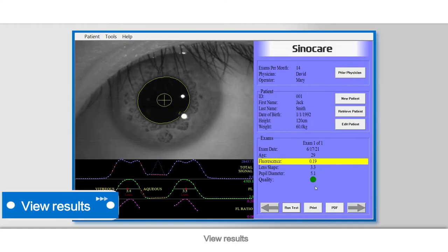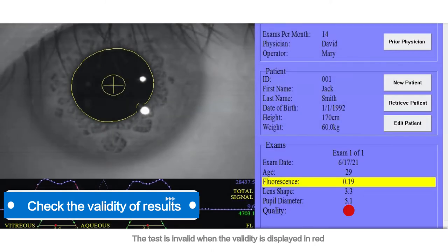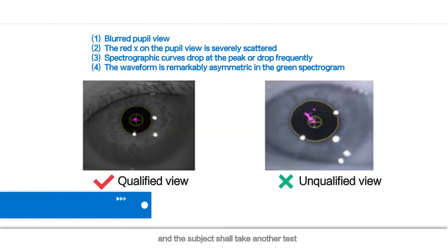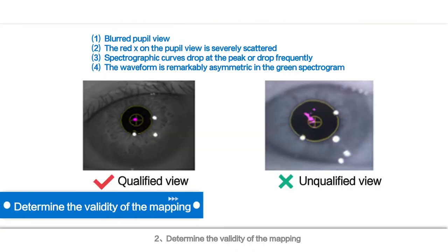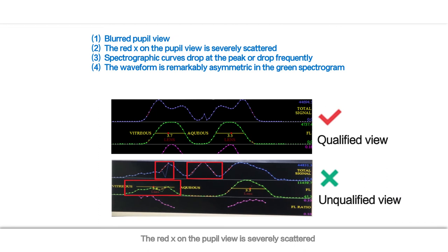View results. 1. Check the validity of results: the test is valid when the validity is displayed in green; otherwise the subject shall take another test. 2. Determine the validity of the mapping. When the following conditions appear in the mapping, it indicates that the testing was not performed correctly and a new test is recommended: blurred pupil view; the red X on the pupil view is severely scattered; spectrographic curves drop at the peak or drop frequently; the waveform is remarkably asymmetric in the green spectrogram.